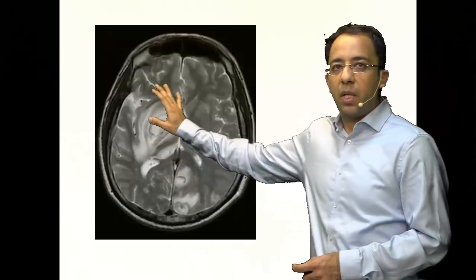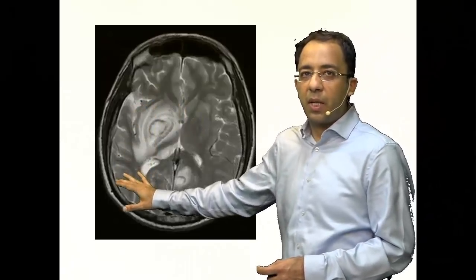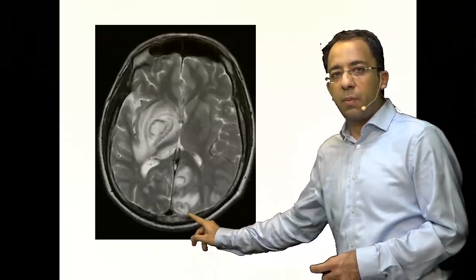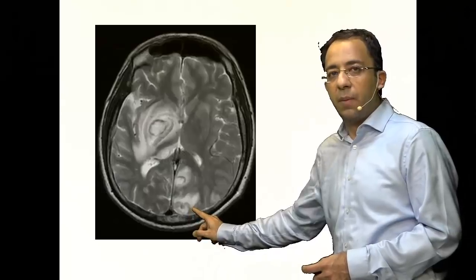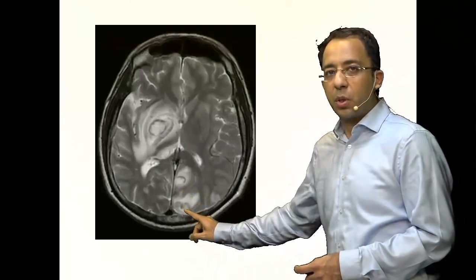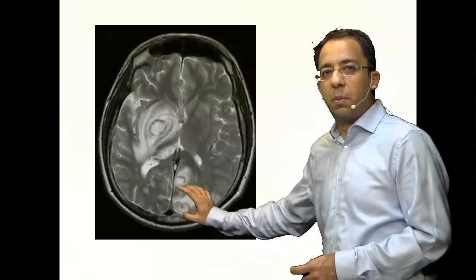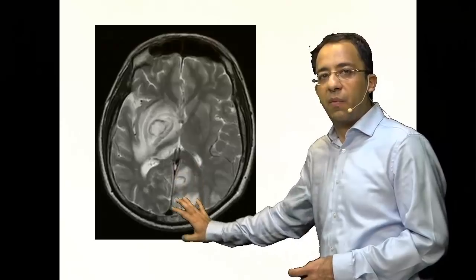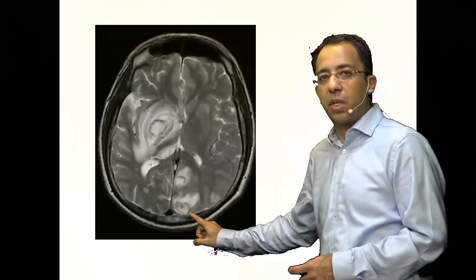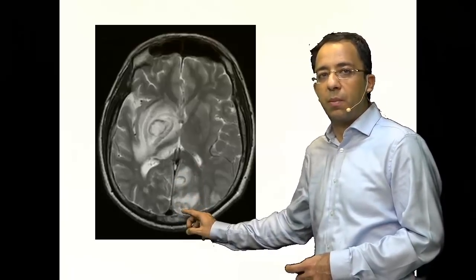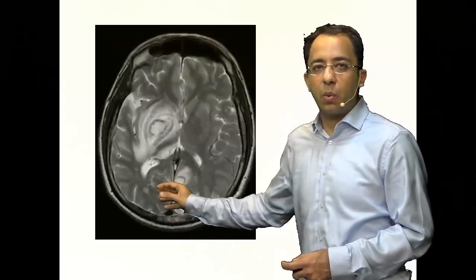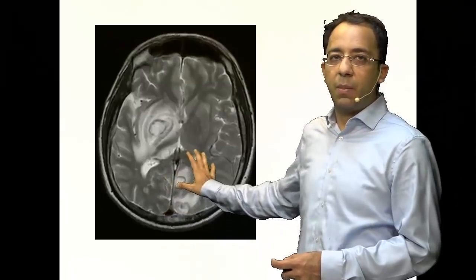The entire white area surrounding the lesion is edema in the basal ganglia area. You also see similar lesions in the cortex, in the occipital lobe, typically at the gray-white matter junction — that hypointense rim, bright lesion with surrounding edema.